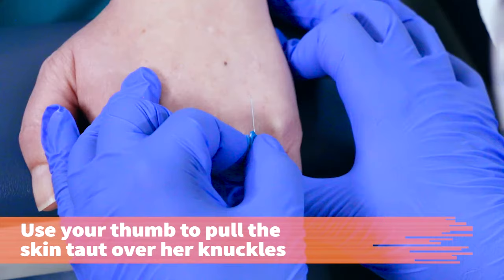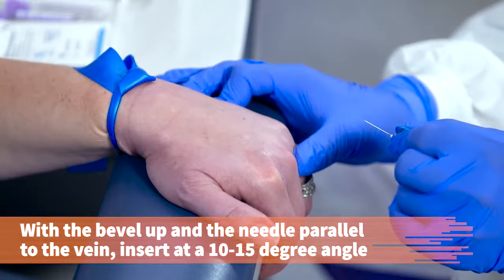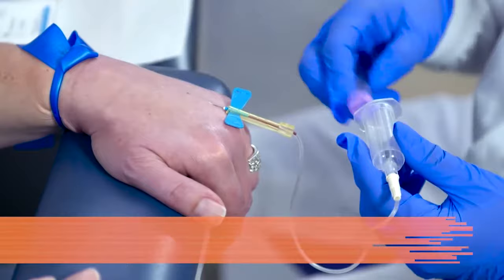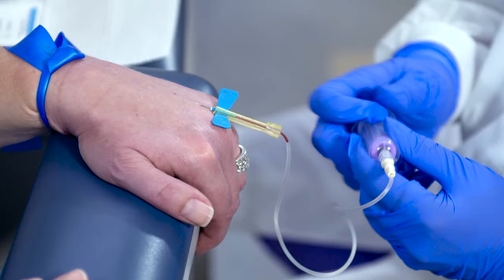Use your thumb to pull the patient's skin taut over her knuckles. With the bevel up and the needle aligned parallel to the vein, insert the needle at a 10 to 15 degree angle through the skin and into the vein with a quick but smooth motion. After inserting the needle, do not touch the wings again until the butterfly needle is removed. Push the blood collecting tube into the end of the holder. Place two fingers on the flanges of the needle holder and use your thumb to push the tube onto the double pointed needle. Make sure you do not change the needle's position in the vein.